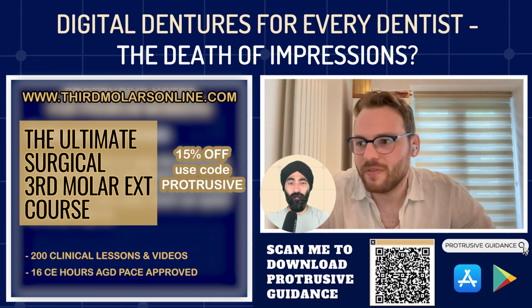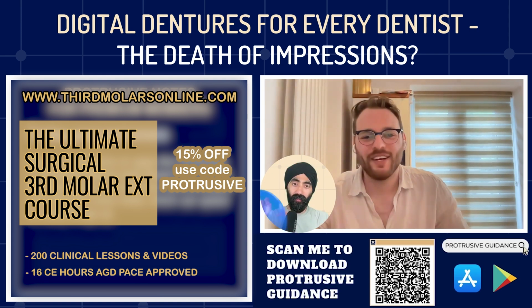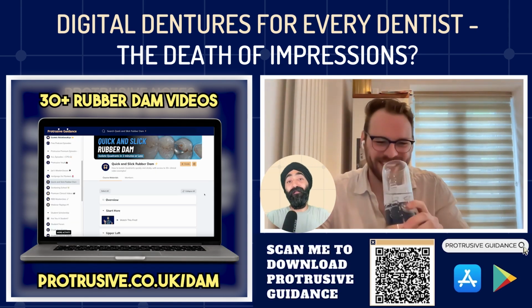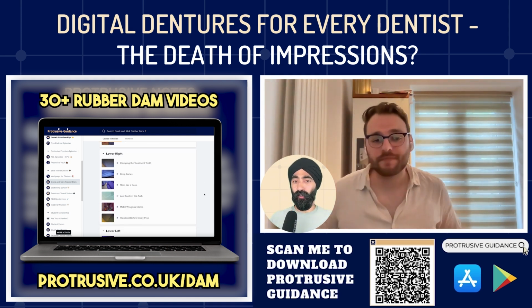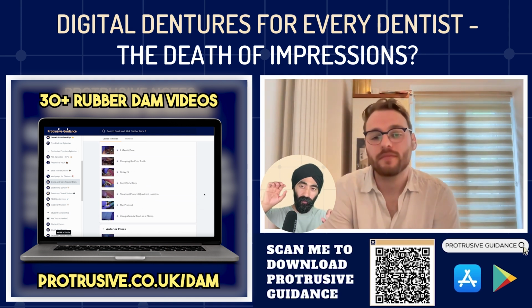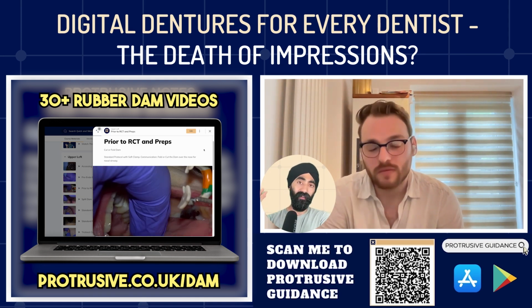And mine's usually a 2-word prescription. Then email. In the email, I've got all my stuff, my photos, and my Loom videos saying, Graham, have a look at this. Can you replicate this? I think I'll need a guide plane here. What do you think?